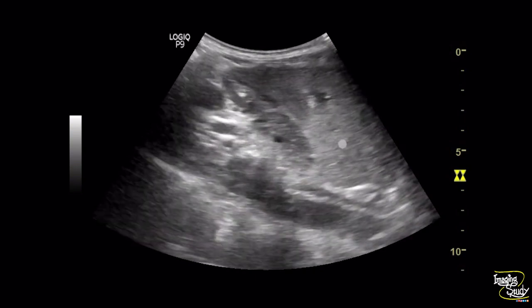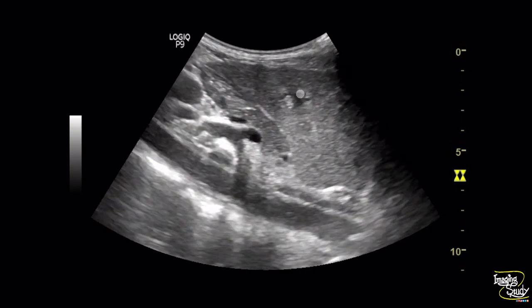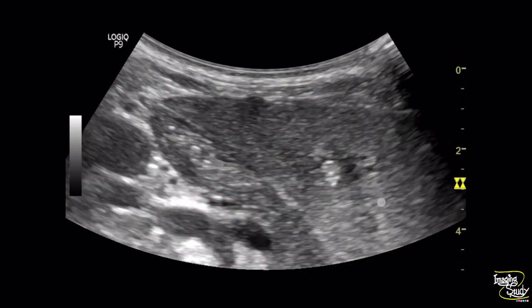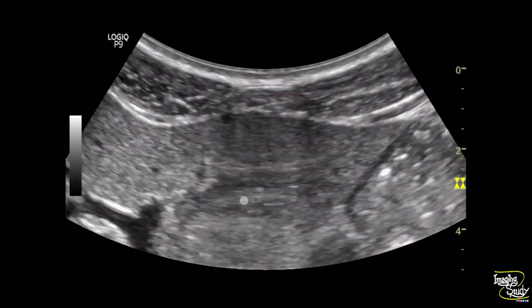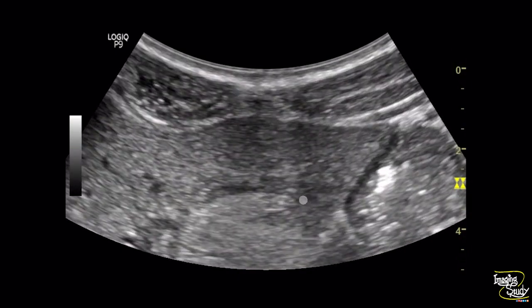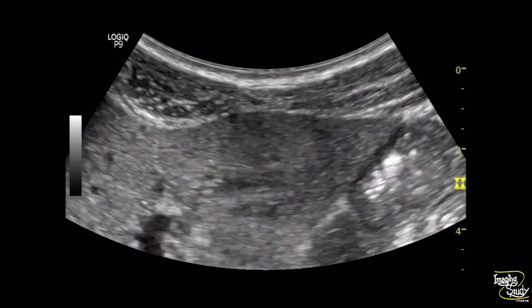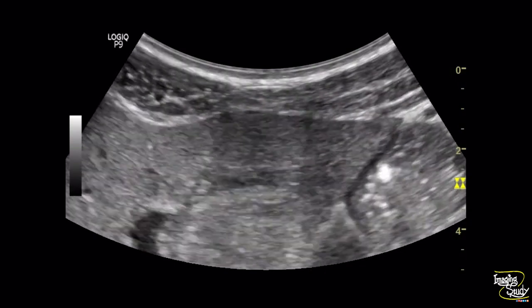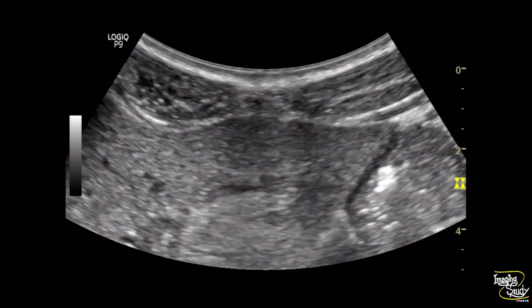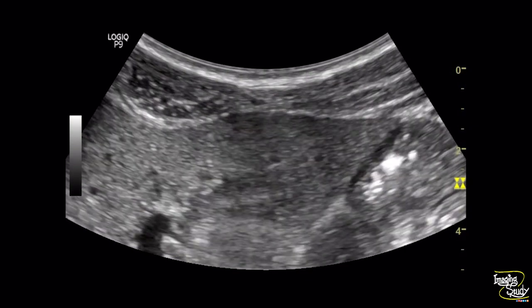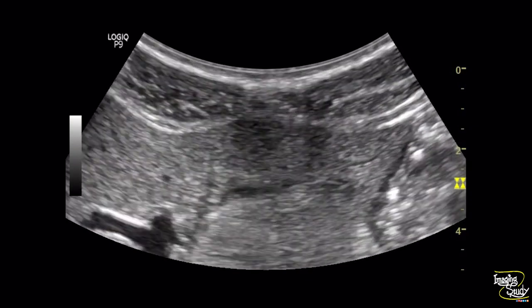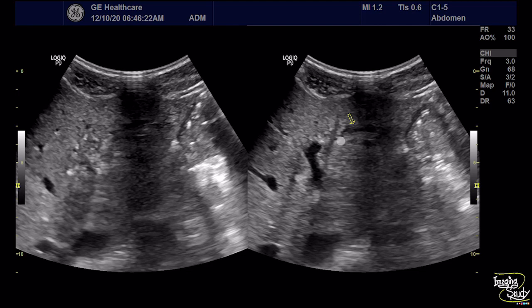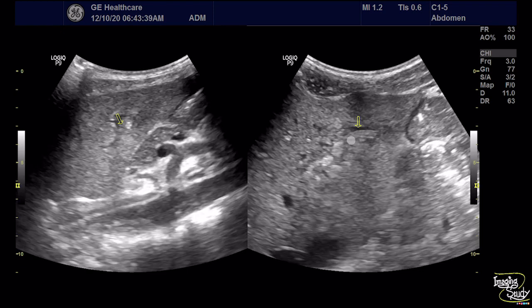You can focus again and magnify the image to see the worm with surrounding hypoechoic inflammatory ductal changes. This is the hyperechoic linear tubular structure with hypoechoic surrounding wall thickening indicating biliary ascariasis. Here are pictures of the biliary ascariasis with surrounding inflammatory changes.